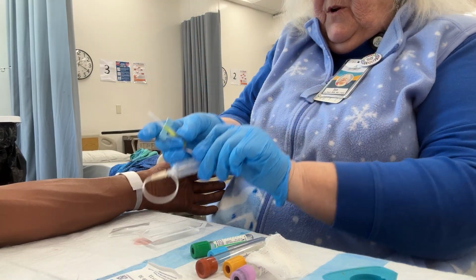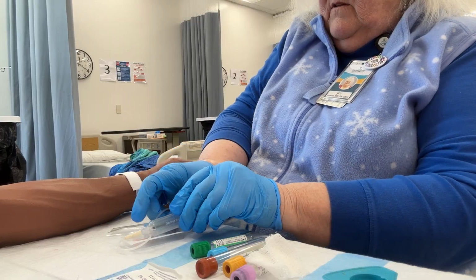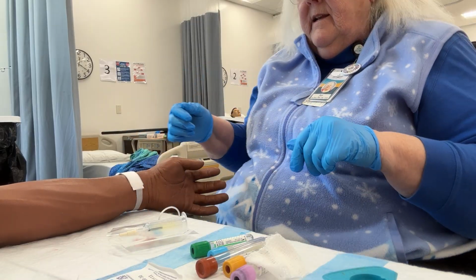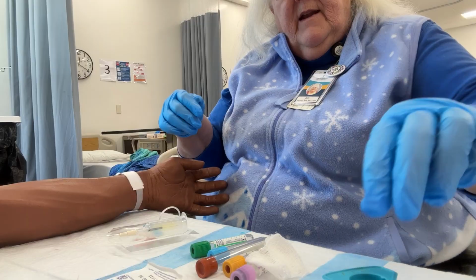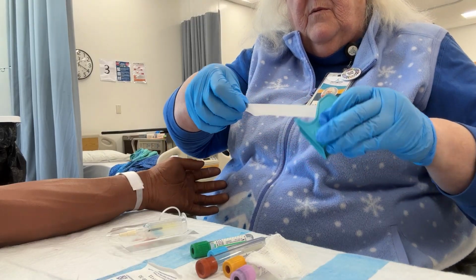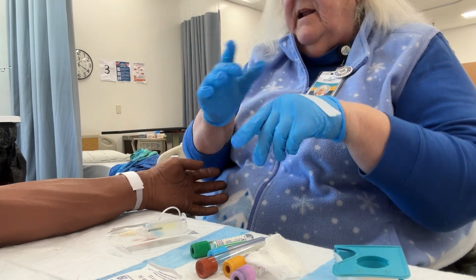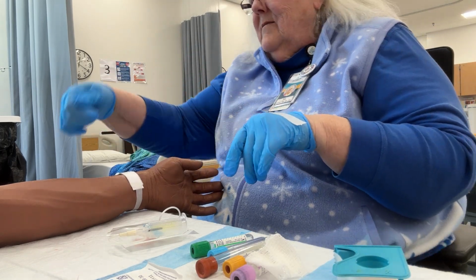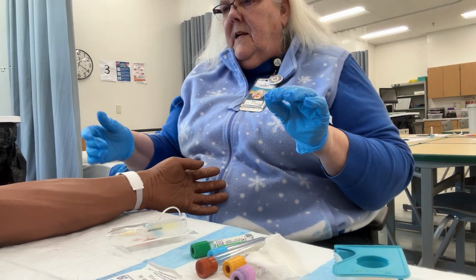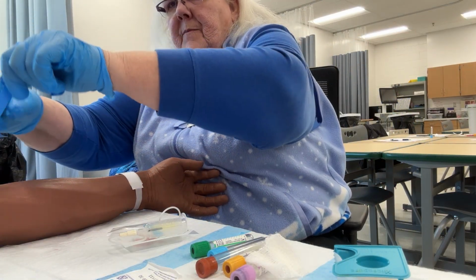Okay, I'm going to put all of this back in the tray because I want it to stay sterile. I don't want to take a chance of getting anything on the table. Now that I have my gloves on, I'm going to take my tape, pull my tape, and I'm going to stick it on the back of my gloved hand. You'll see people sticking tape everywhere, and that ends up getting germs. Now I'm going to pull up on my tourniquet.